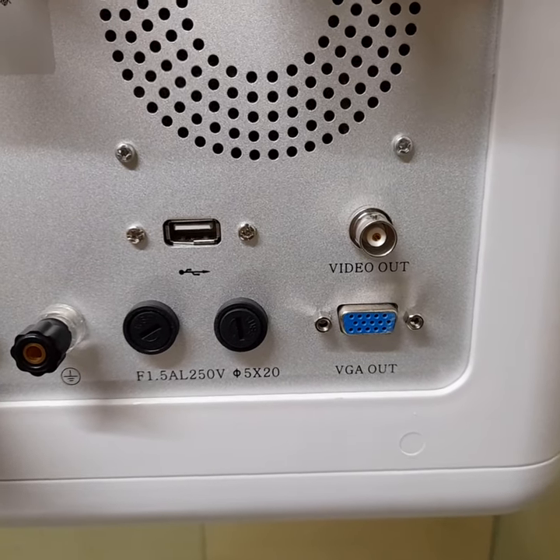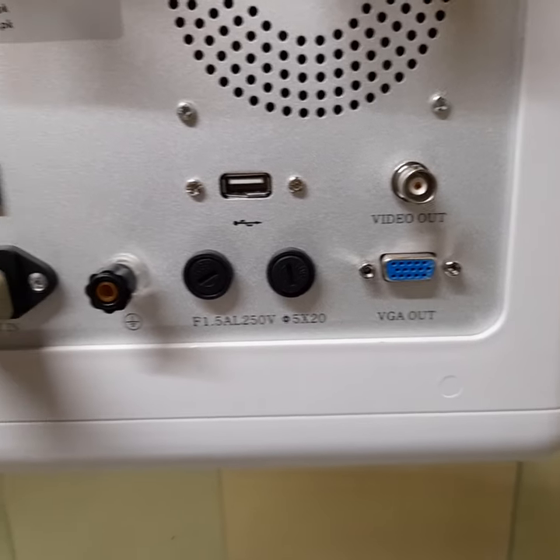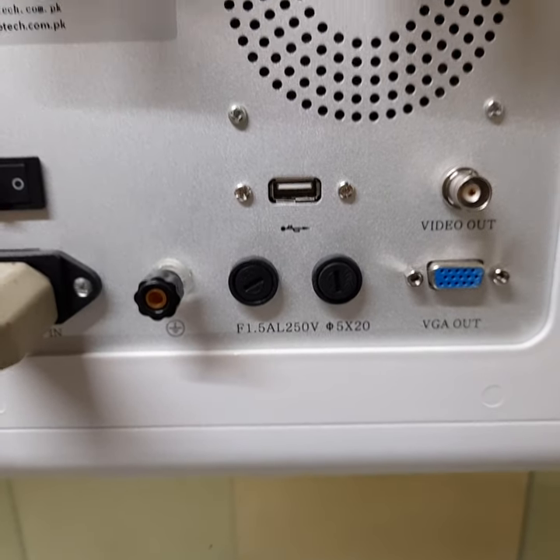Video Out for Printers. VGA Out for Monitor. Fuses and USB Port.